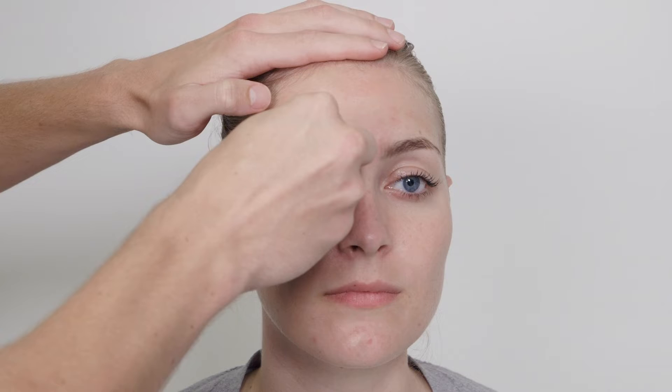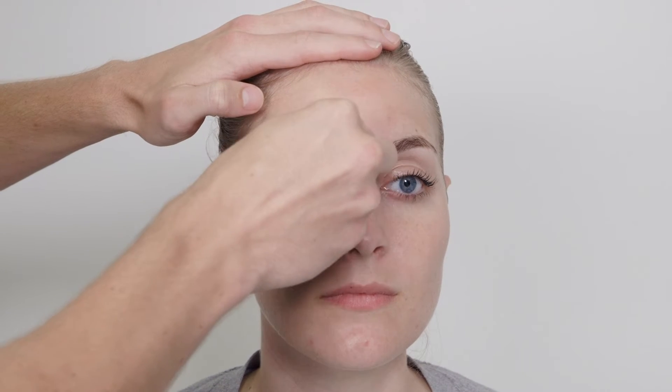Clean the patient's skin on the forehead, between the eyes, and under each eye.